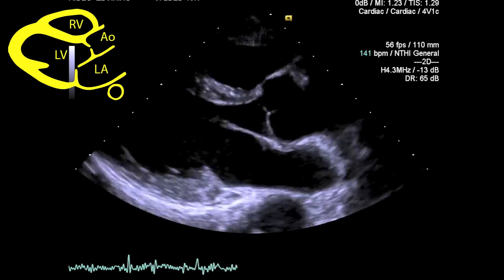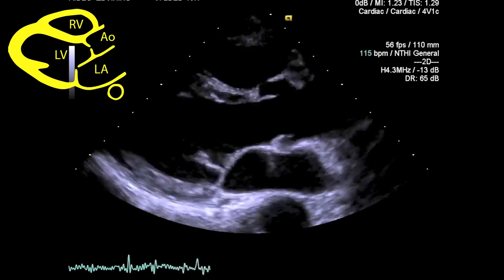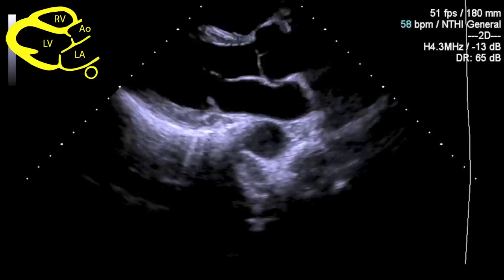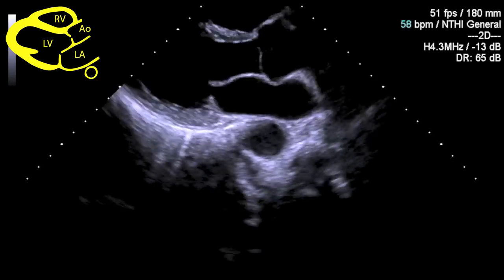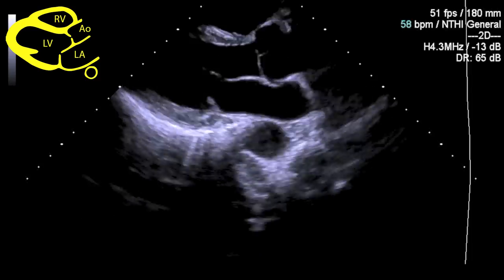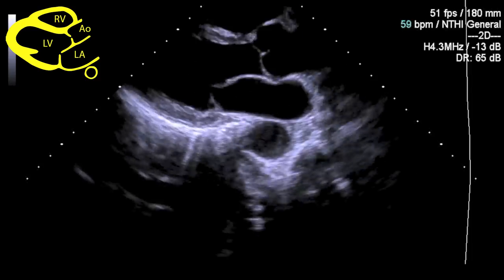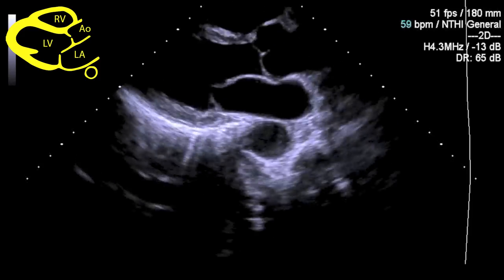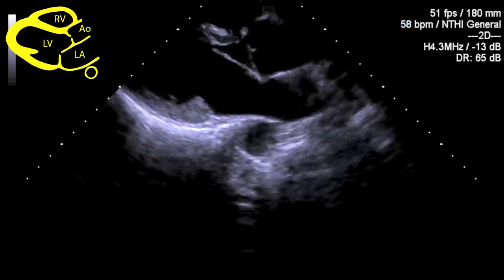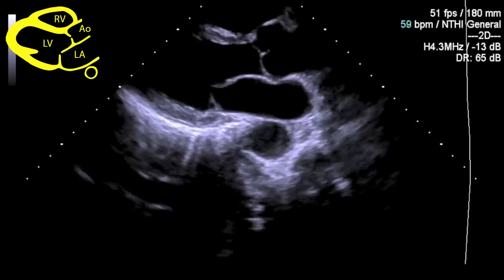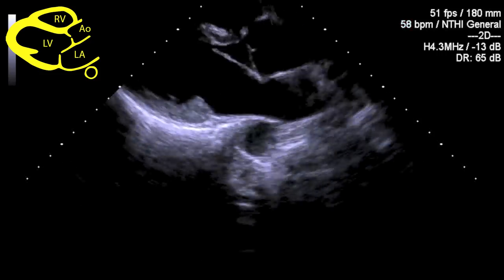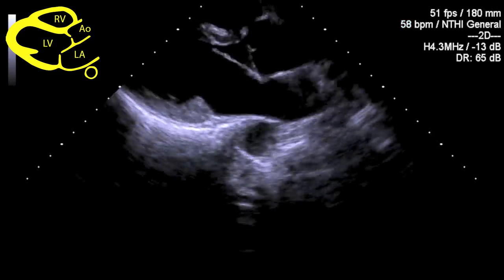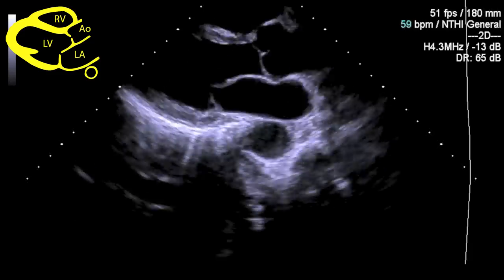Make an assessment of the right ventricular size and contractility. Have a look at the pericardium, which lies behind the heart, in front of the descending aorta but behind the inferolateral wall of the left ventricle. A pericardial effusion will be seen in this position. Anything distal to the descending aorta is likely to be a pleural effusion.